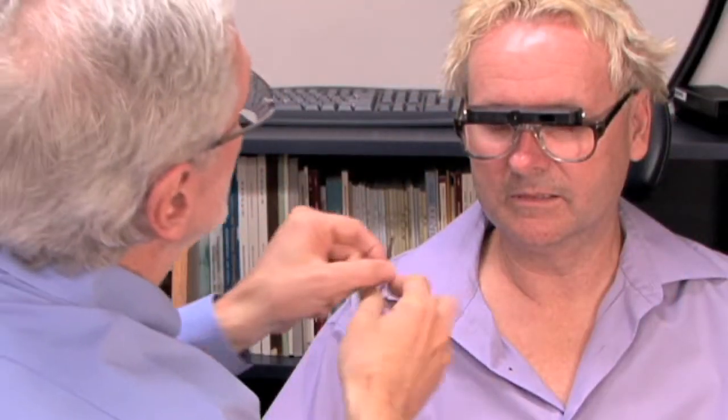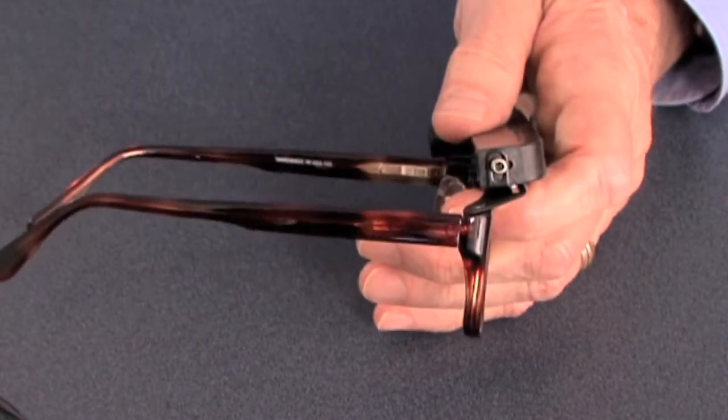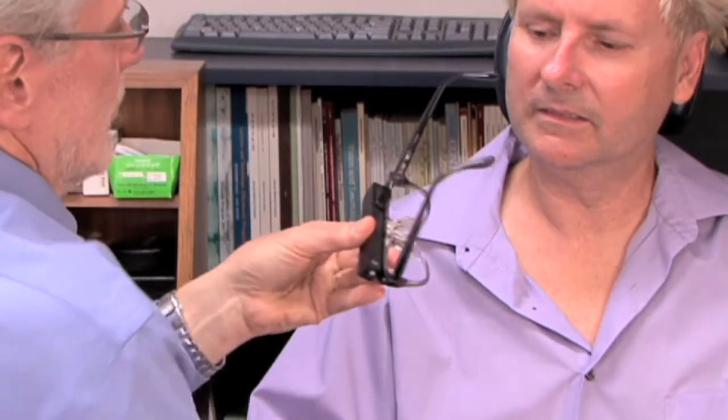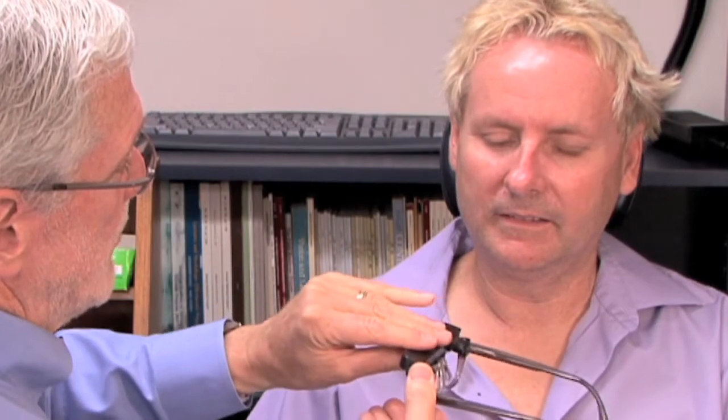We don't want the telescope so loose that it won't stay where you leave it. So I'm going to tighten the side screws up just a little bit — not so snug that I can't move it, but not so loose that it won't stay where you position it. Now we can change the angle and it's staying where we would like it.